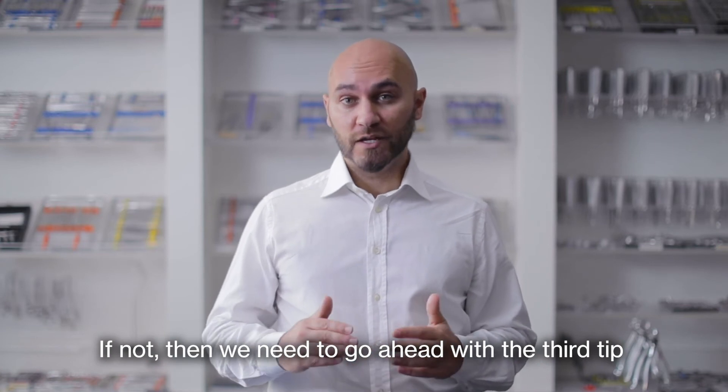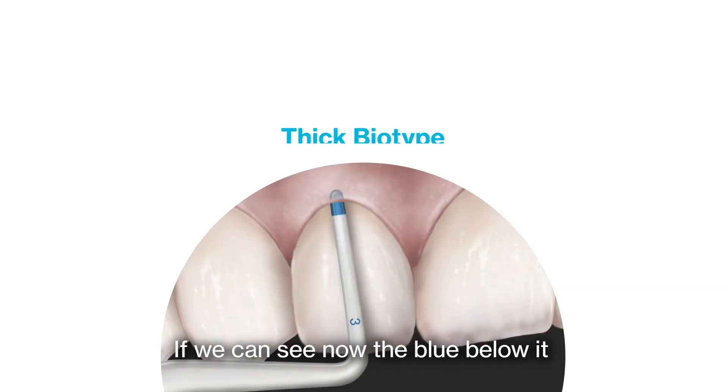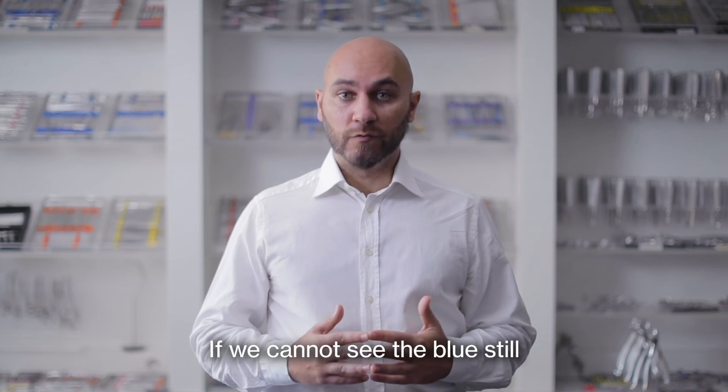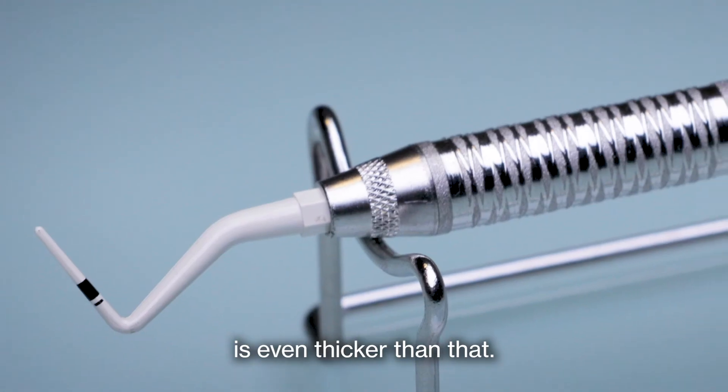If not, then we need to go ahead with the third tip, which is the blue one, the darkest one. If we can see the blue below, it means that we are in front of a pretty thick biotype. If we cannot see the blue still, it means that the biotype is even thicker than that.